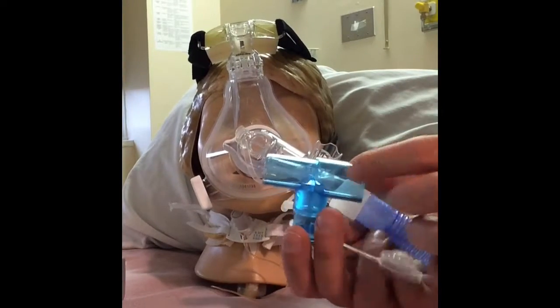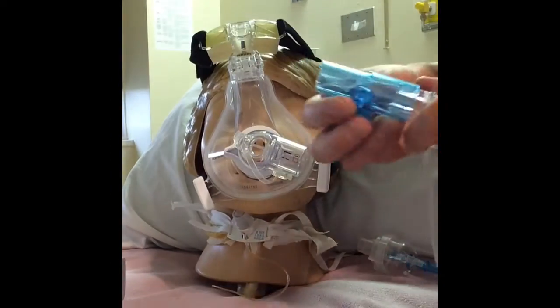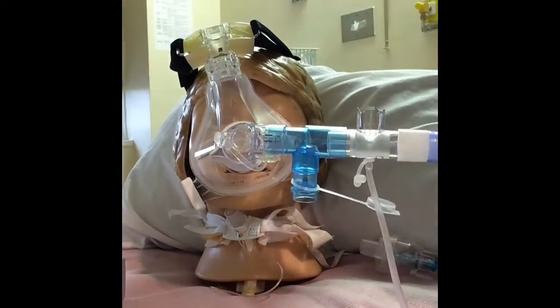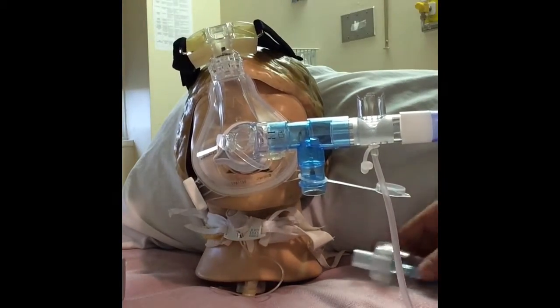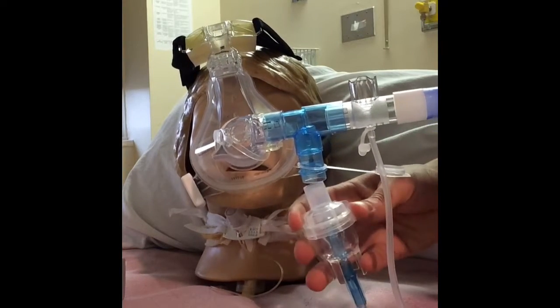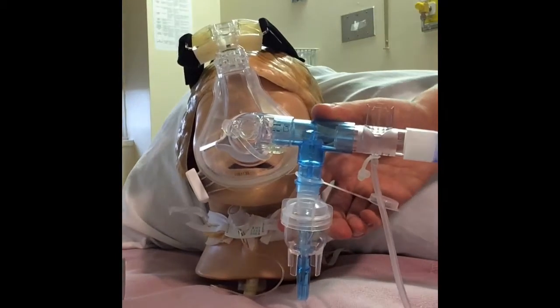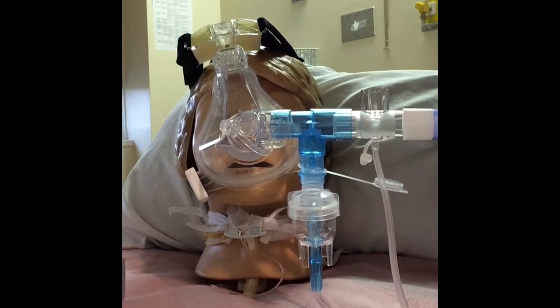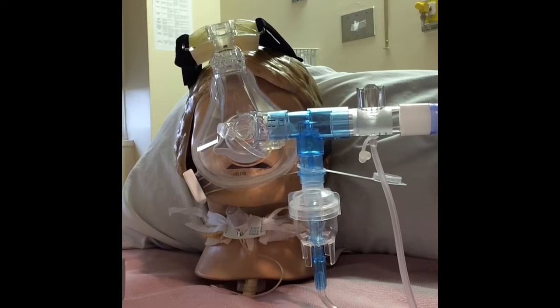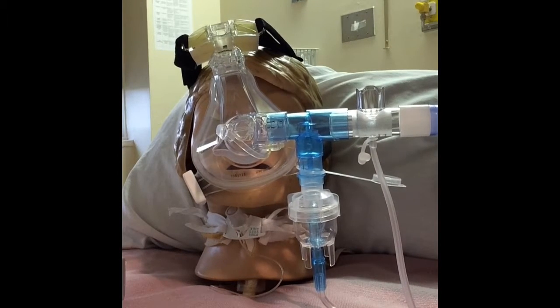Nebulizers. You're going to grab out of your bag the blue T-piece. The blue T-piece is going to go in between your circuit, your tubing, and the mask. Okay? So it's going to look like that. You're going to grab your neb cup, just like you normally would, and it gets plugged into the bottom. Put that in the bottom, then you would just run your tubing to your air or your oxygen, and run that at 8 liters until you don't see any more medication in there. Usually it's about 8 minutes.